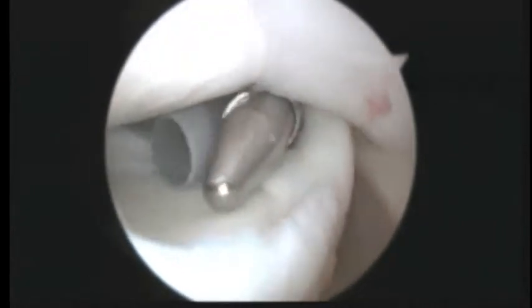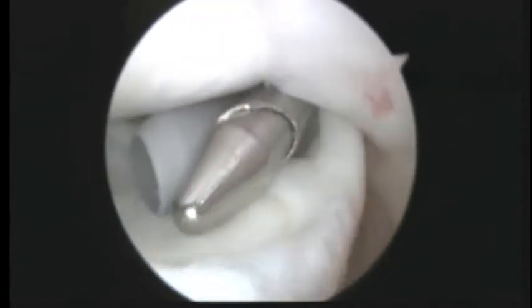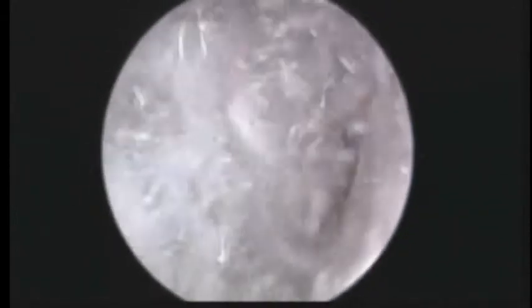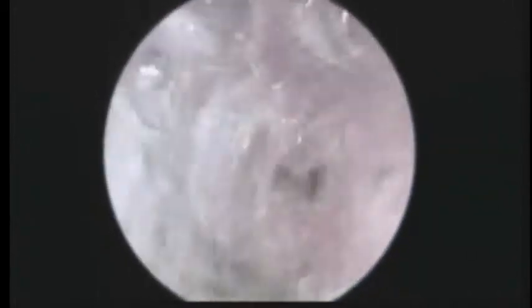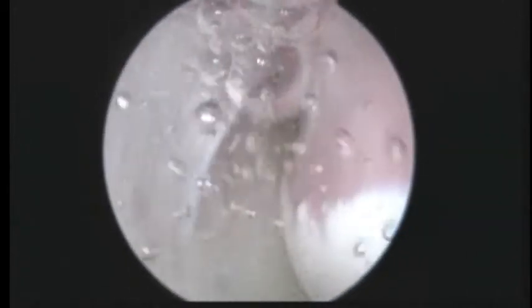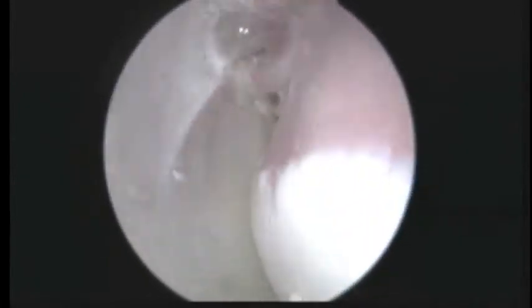Hold these two cannulas in. And as we rotate the camera and look towards the bottom of the shoulder, we'll have a look at the capsule down here. And that posterior capsule is something we're going to be tightening here in just a minute. We may have to put an anchor in, depends on how stable that labrum is right on the edge there.